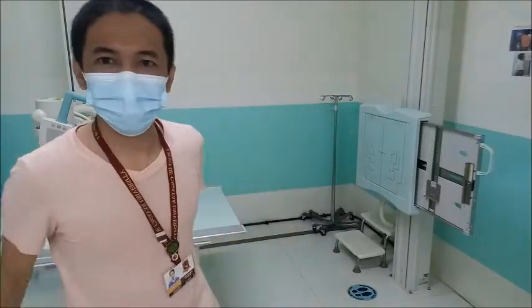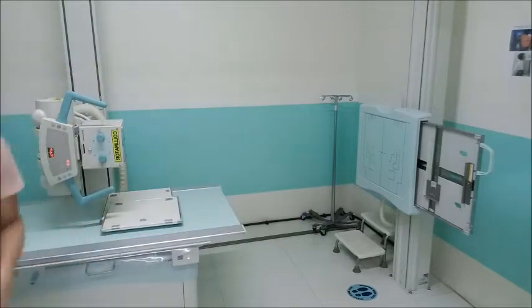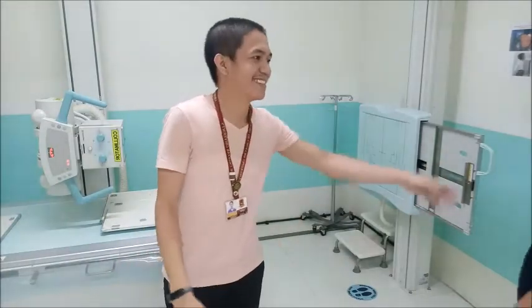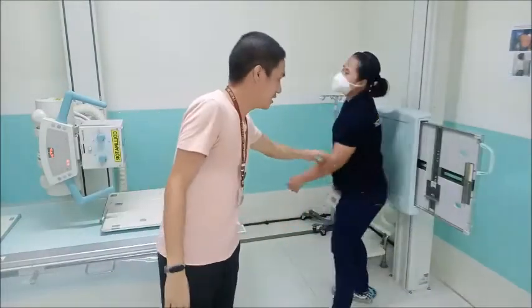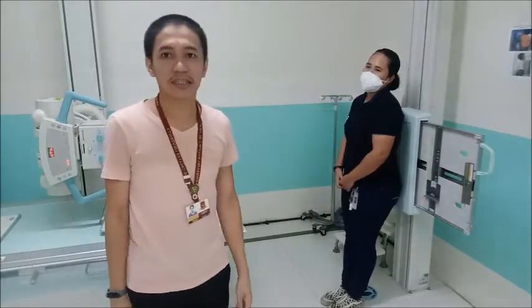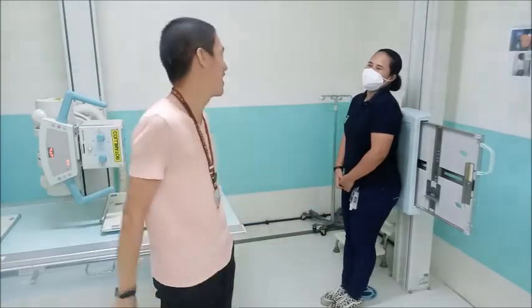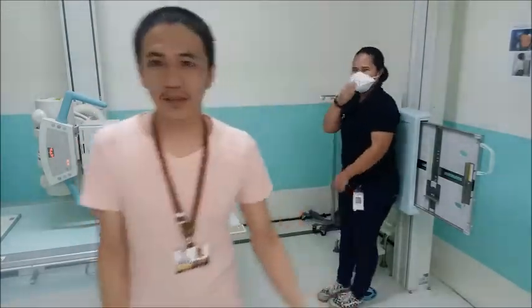Patient. Another patient. Another patient. Okay, so again, this is for the chest examination. You have a patient. This patient is not yet hypersthenic, he is sthenic, a sthenic reaction in body build.